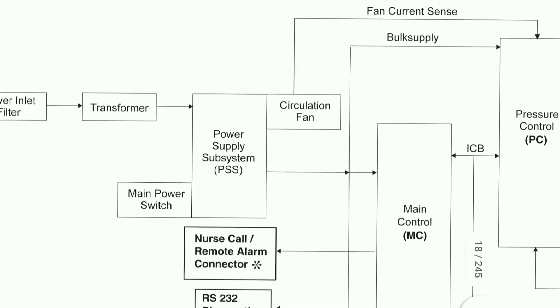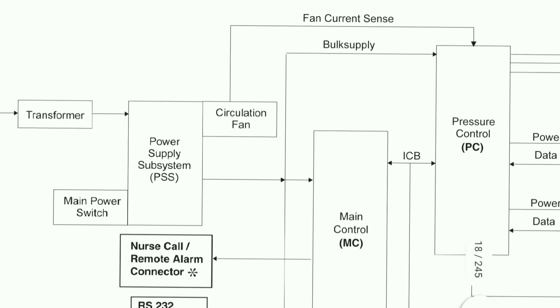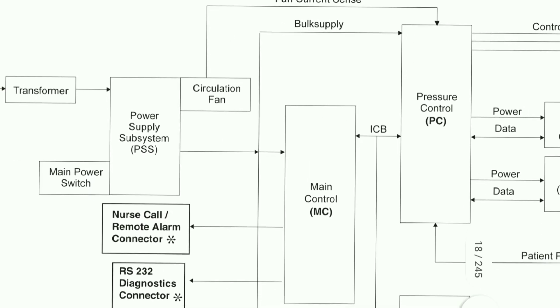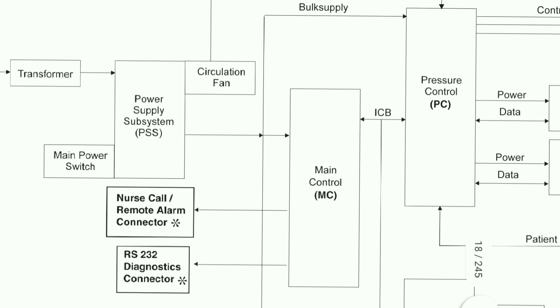The power supply gives output to fan current sense, to pressure control, and from the power supply it goes to the bulk supply and main control — the MC. There are also nurse call and remote alarm connectors in the main controller, as well as an RS232 diagnostic connector.